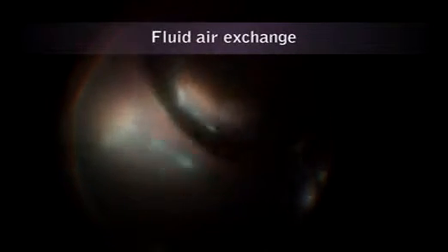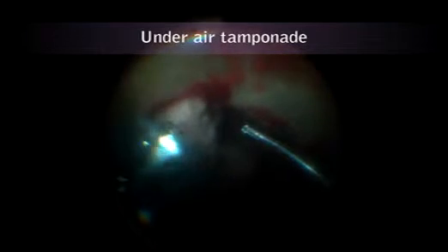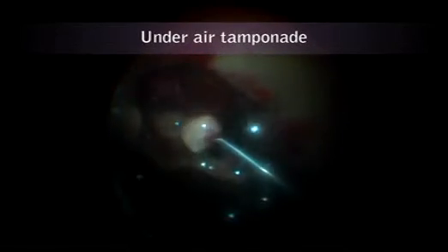To overcome this, fluid-air exchange was done and vitrectomy was continued under air infusion. Air tamponade stopped the bleeding, permitting a better view of the blood clot. Additionally, the retina periphery could be better visualized. All blood clots were gently removed, avoiding any pull on the retina.